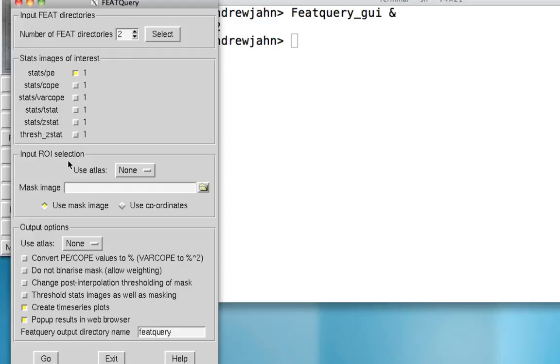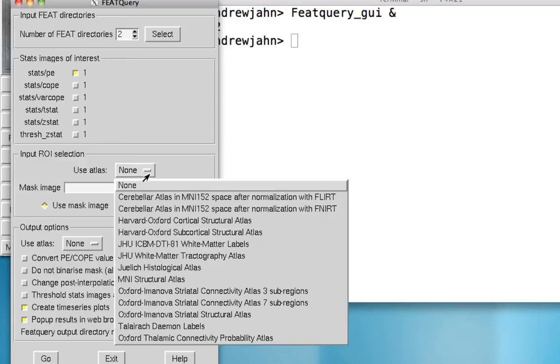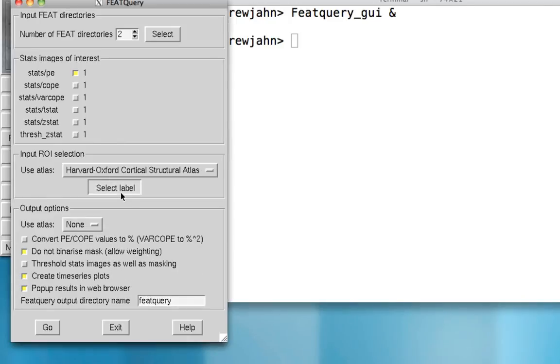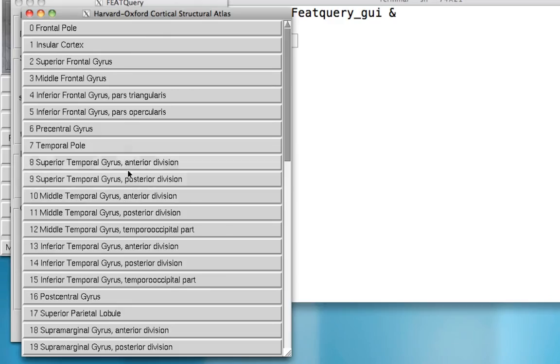For the region of interest, you can either select one of the atlases, like we did during our creating the ROI tutorial. For example, the Harvard-Oxford Cortical Structural Atlas. And within that, you can select labels for the different structures that you want to use as an ROI.